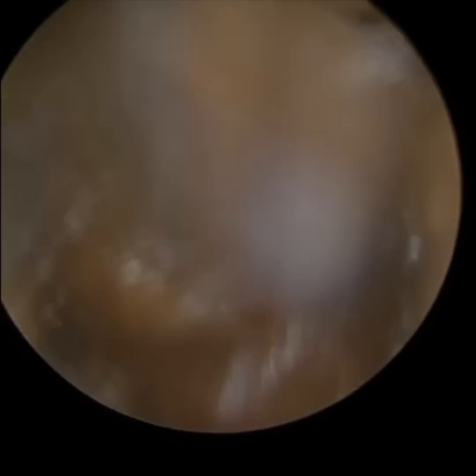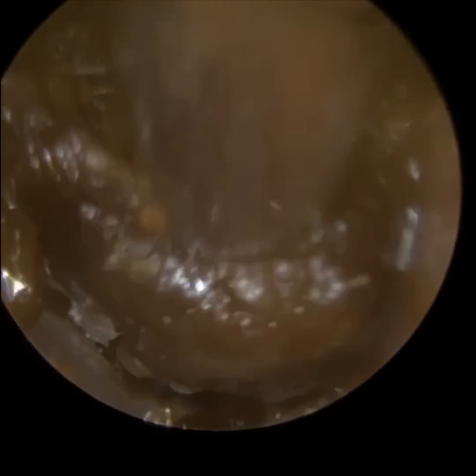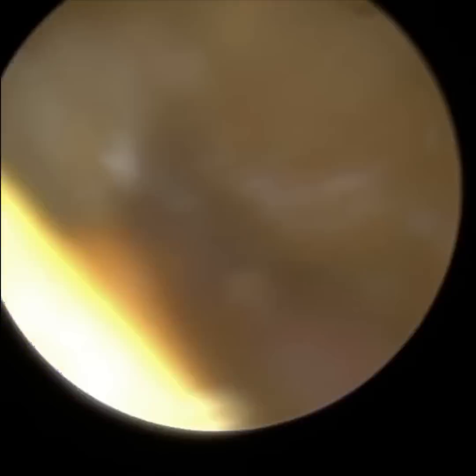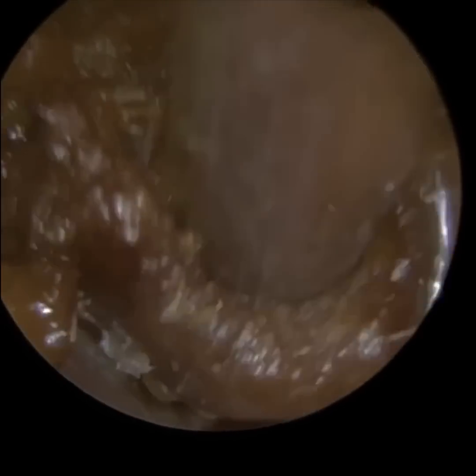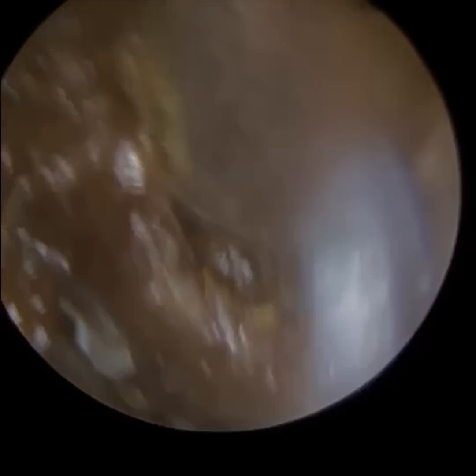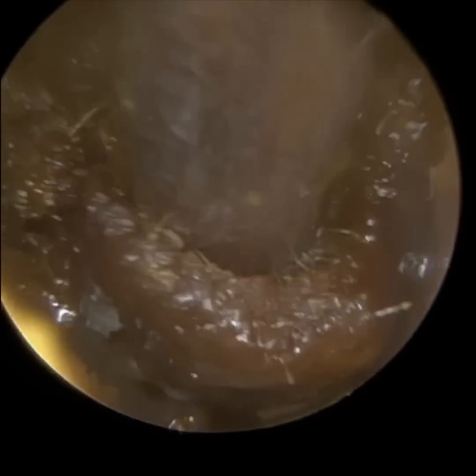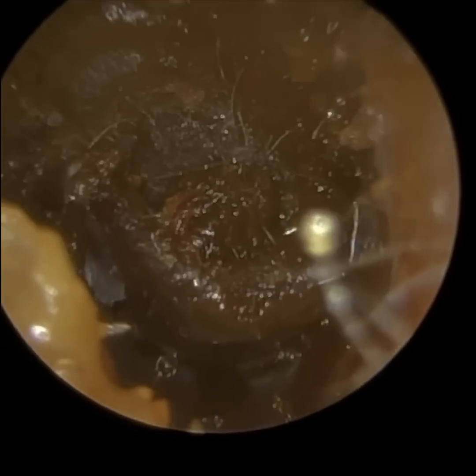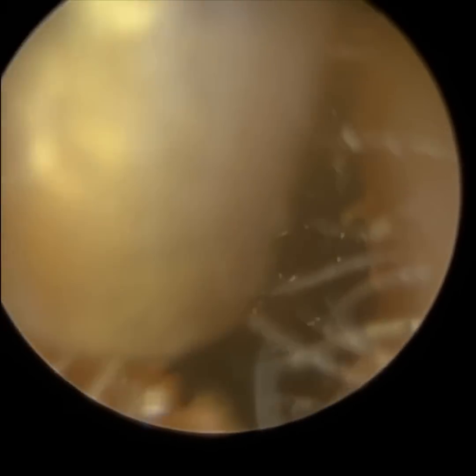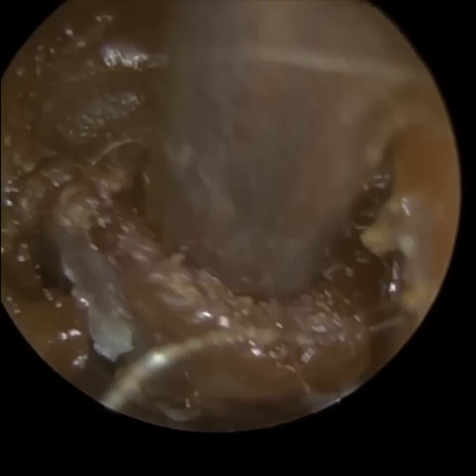Now in part it's also blurring because the oil's in the ear still as I'm suctioning, so the suction probe is also suctioning the oil, and as it's suctioning the oil, you can get a bit of blurring. And slowly now it is working out. And the reason why this wax plug put up a little fight is because once I remove this, you'll see that there are some plugs of wax on the eardrum, and I suspect they were attached to this main plug. And as I removed the main plug, those three remaining plugs separated and stayed connected to the eardrum.